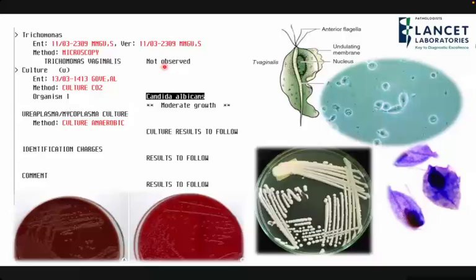And we also do cultures. So cultures, the main thing that we're looking for is your Candida, and Candida grows very well. So this is Candida albicans. And we can see Neisseria as well. This is Neisseria, but it's very fastidious, and sometimes you can't culture these organisms. That's why we always say we prefer molecular testing, but culture has to be done as well. And for us, the only way we can do sensitivities is through a culture, and molecular assays don't do sensitivities. And your ceftriaxone-resistant Neisseria gonorrhoeae is notifiable, and that's why we need culture.